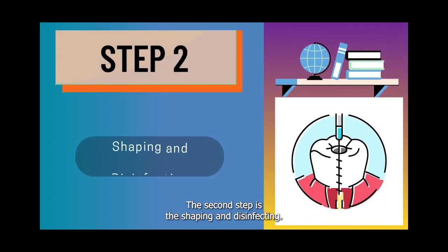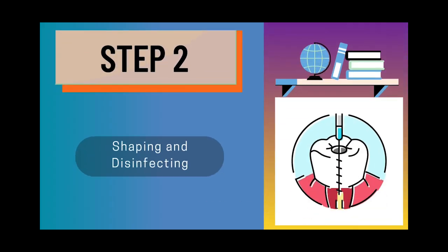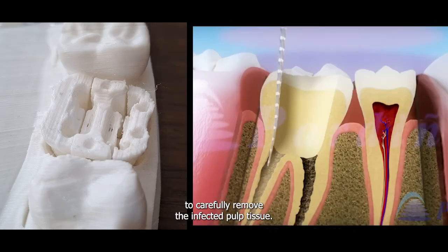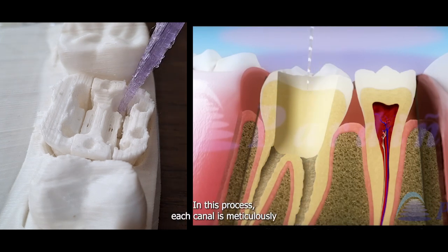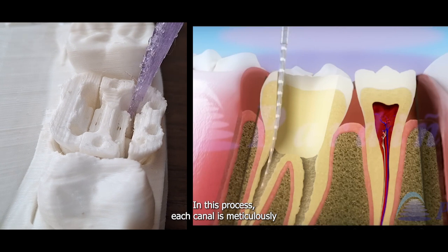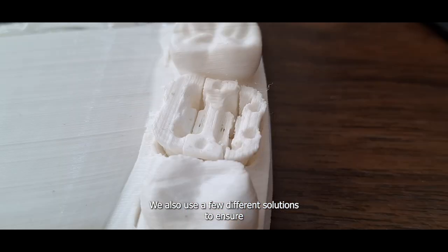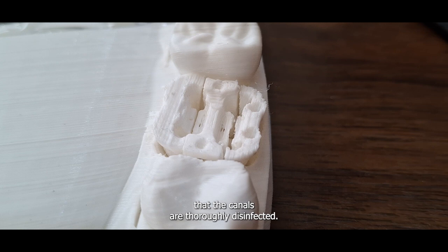The second step is the shaping and disinfecting. Once inside, we use tiny flexible instruments called endodontic files to carefully remove the infected pulp tissue. In this process, each canal is meticulously cleaned and shaped, but the files aren't enough on their own. We also use a few different solutions to ensure that the canals are thoroughly disinfected.